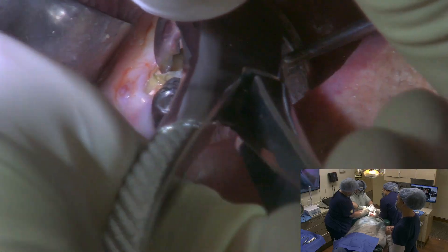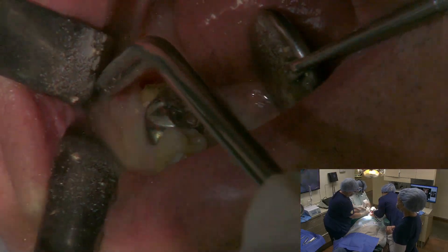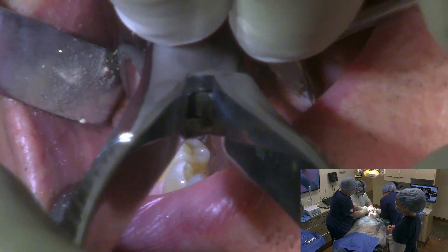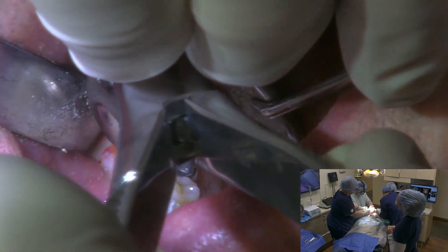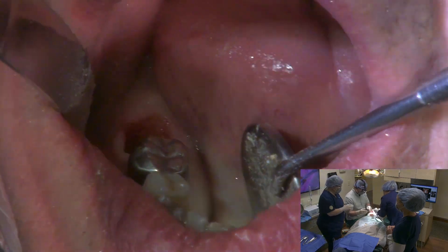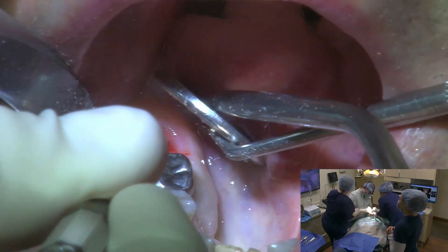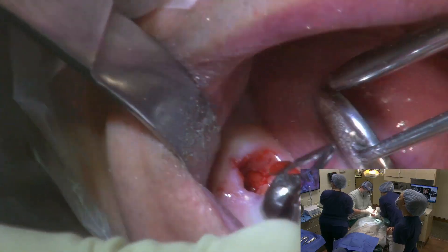This tooth is just fractured in a number of different pieces — there we go, beautiful. All right, wonderful. Praise the Lord. Let me have a curette please. Tooth is out — just as we expected.